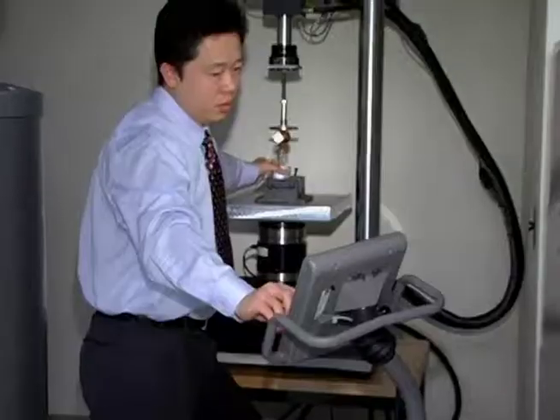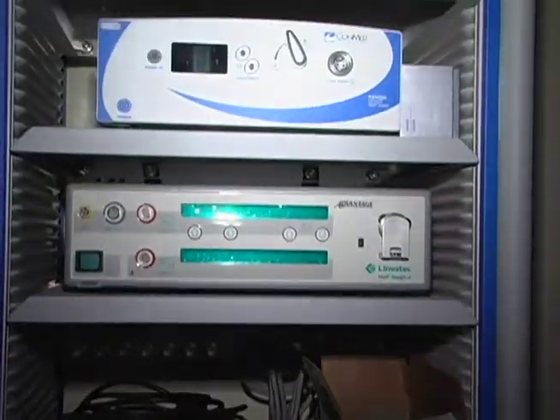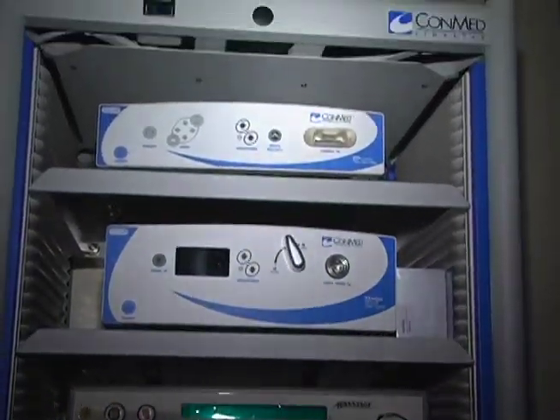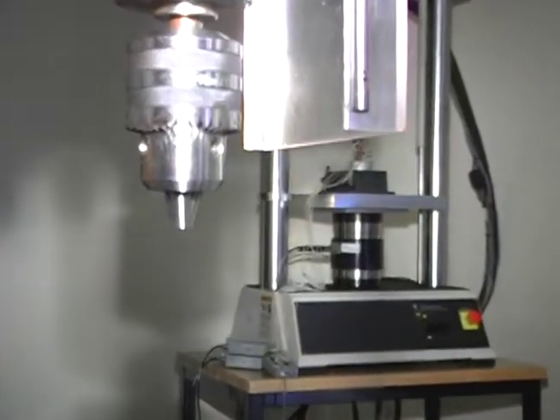It will stimulate many individuals who previously did not participate in research to start doing so, and it will hopefully result in an application for an orthopedic residency program. Residents can come to the lab and practice surgery using specialized arthroscopy equipment used to treat such injuries as an ACL tear of the knee or a rotator cuff tear in the shoulder. This will help residents to become better surgeons.